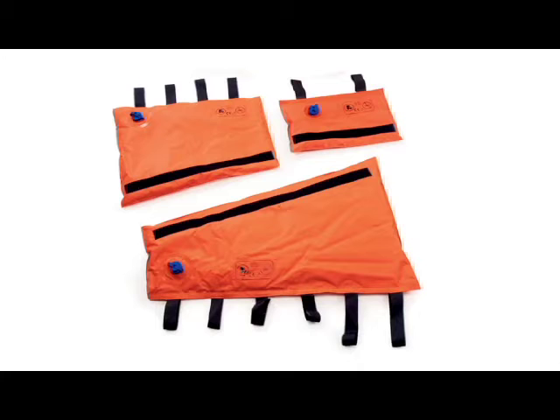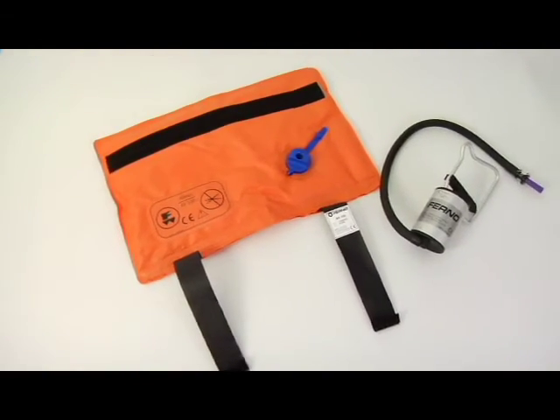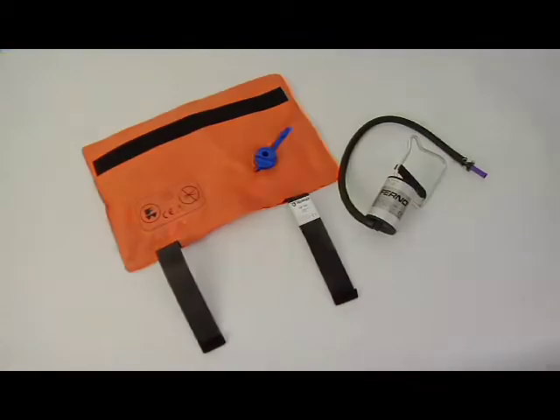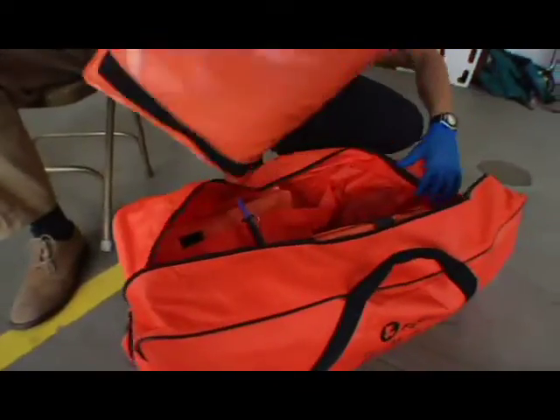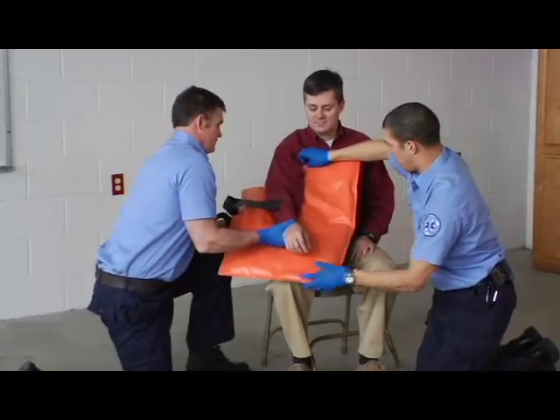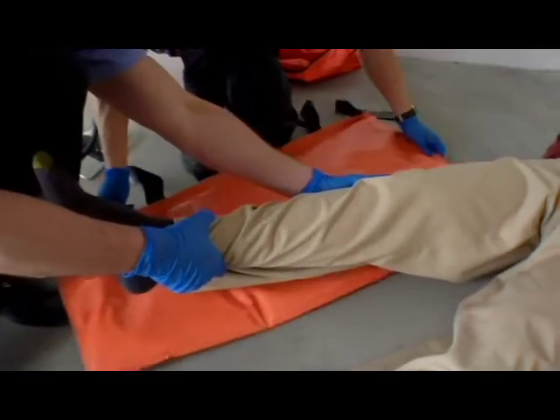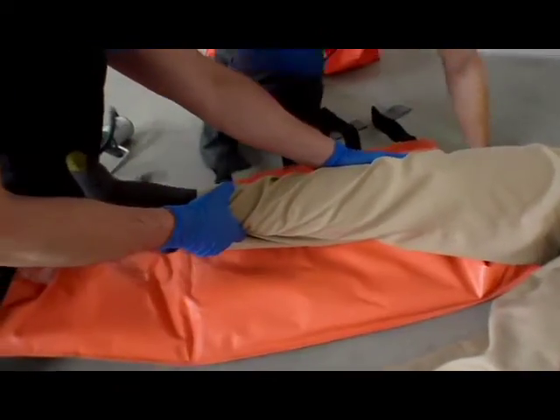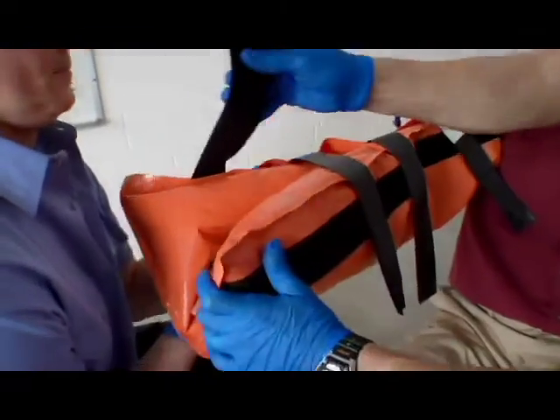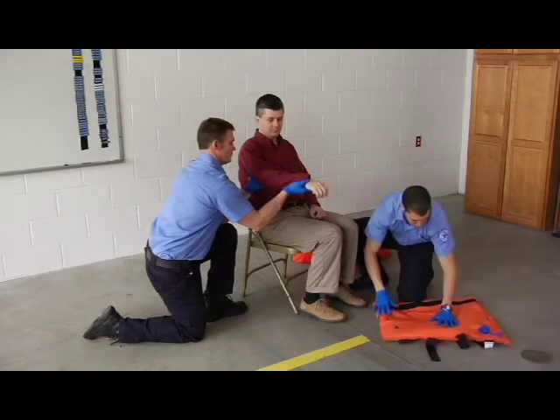FERNO vacuum splints are vacuum activated and designed to immobilize and support an injured part of the body. They are made of durable vinyl coated polyester and filled with polystyrene beads. Choose the splint size that best suits the injury. The splint should be large enough to extend beyond the joints on both sides of the injury. To apply a splint, one operator manually stabilizes the injured part of the body throughout the splinting procedure while the other operator applies the splint.